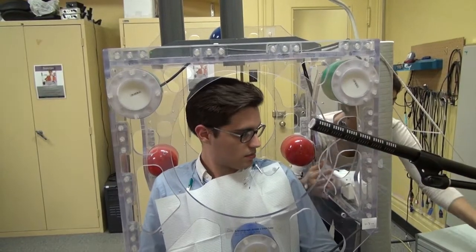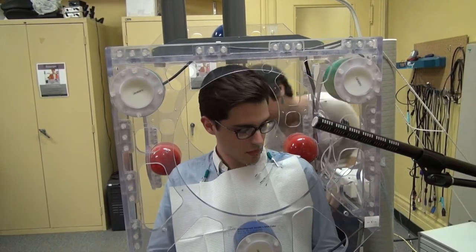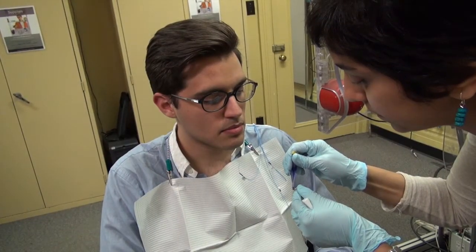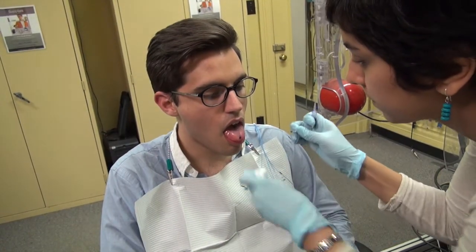The participant sits inside an open cubicle structure that transmits magnetic fields in order to track the position of sensor coils temporarily glued to the participant's lips, teeth, and tongue.